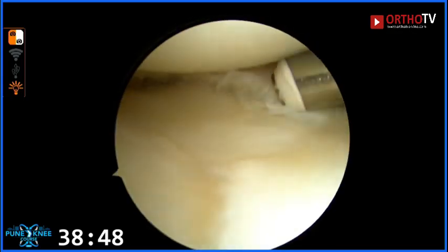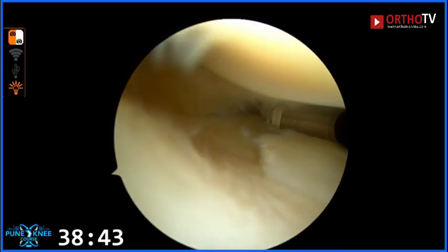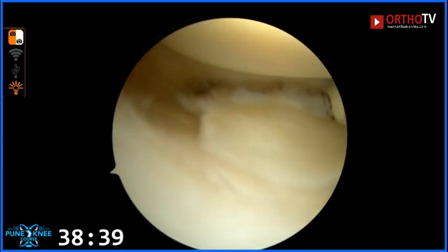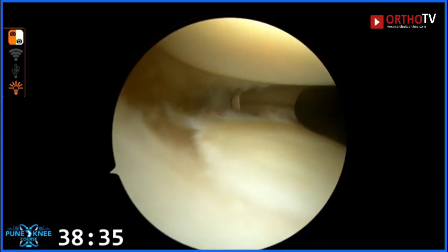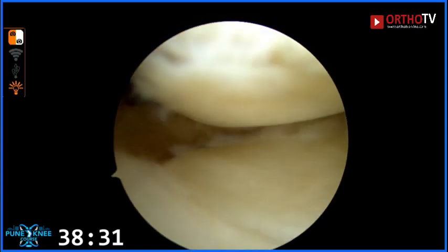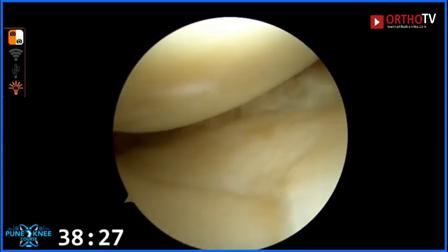So we are trying to look at the root. Yeah, so the root is there. You can see a large flap, and it's almost like the inferior leaf with a superior leaf that's present. Okay, forward a bit. Just forward a bit more.